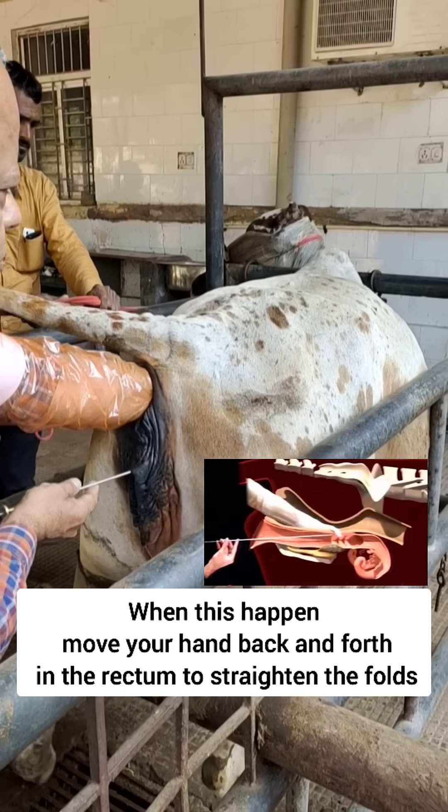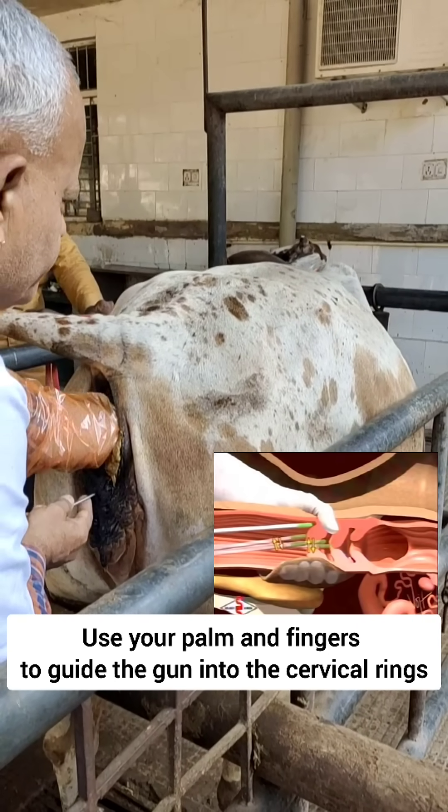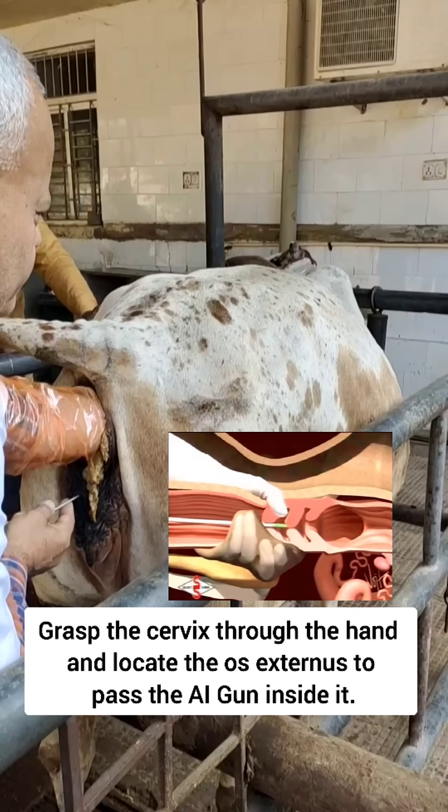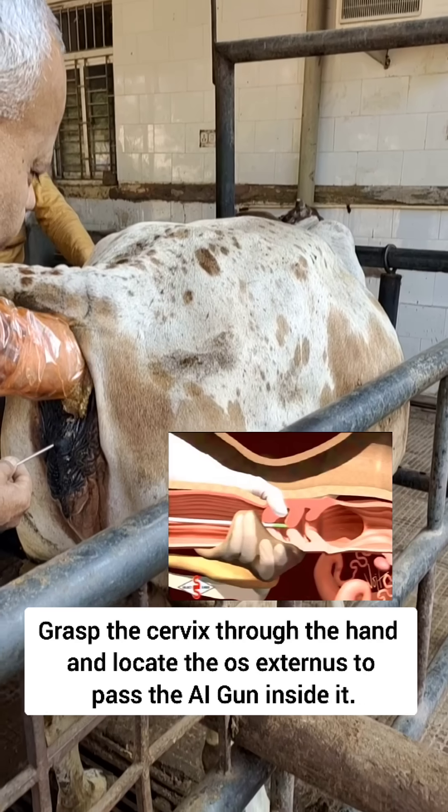The AI gun will reach near the cervix. Now with your fingers and your palm, you can locate the cervix, bring the tip of the AI gun and enter it inside the os externus.